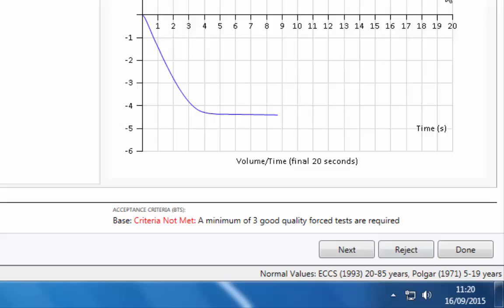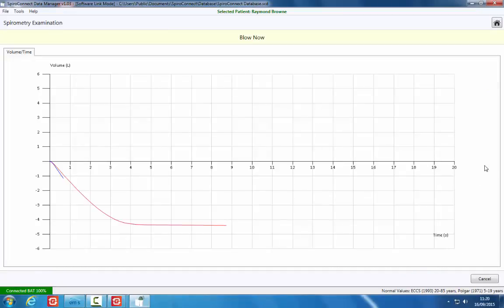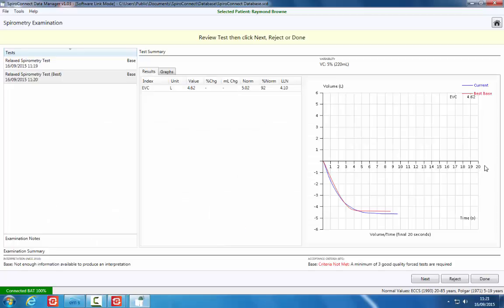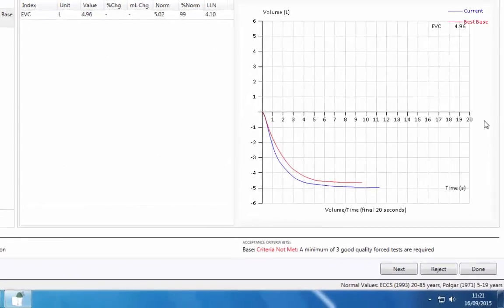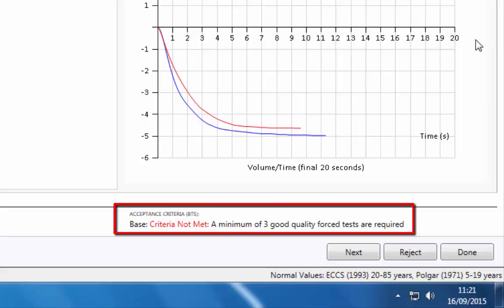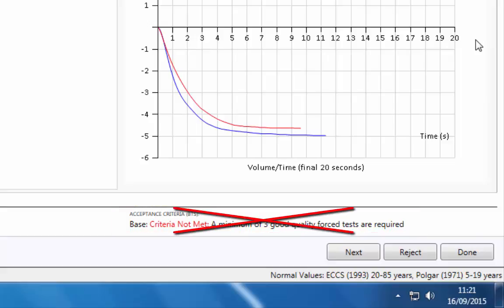To accept the relaxed blow and perform a second, click the Next button. A minimum of three blows of acceptable quality should be performed. The acceptance criteria information only applies to forced blows and can be ignored when performing a relaxed maneuver.